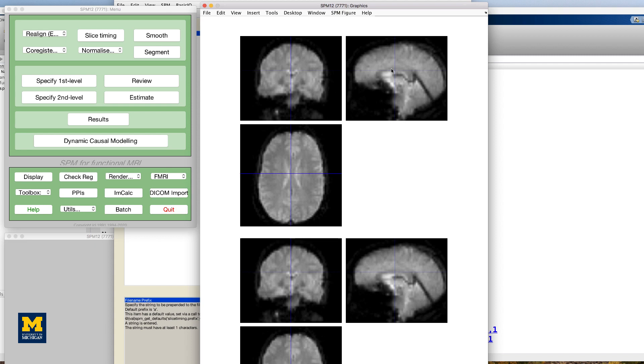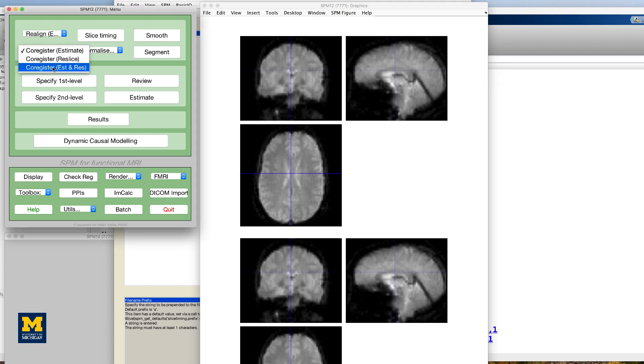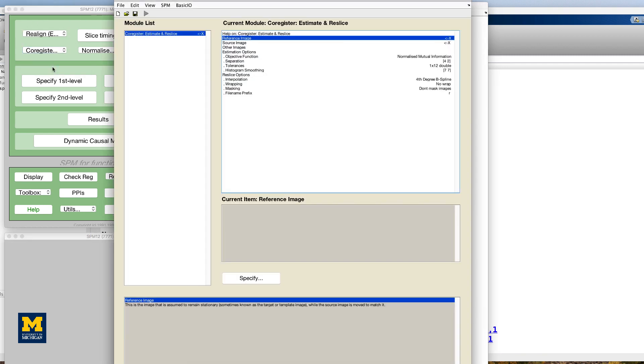Next is co-registration or aligning the functional data to the anatomical data. Click on co-register, estimate, and re-slice. This will open up a batch editor window with only two fields that need to be filled in, a reference image and a source image. The reference image is the image that will remain stationary. The source image, on the other hand, is moved around until a best fit is found between the reference image and the source image.